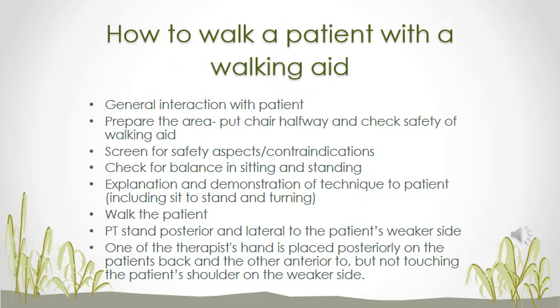So let's go into how you will walk a patient with a walking aid. It's always good and necessary to explain what's going to happen. Often there is fear and uncertainty in your patient, and you always want to communicate very clearly how and what is expected of them.